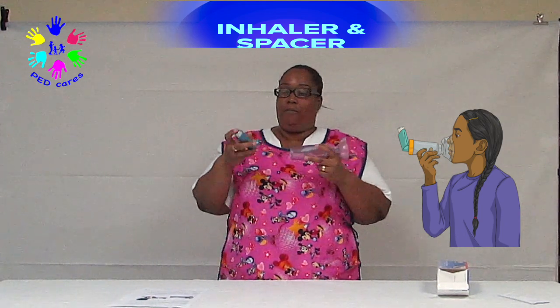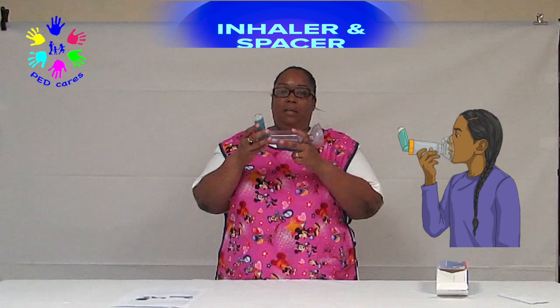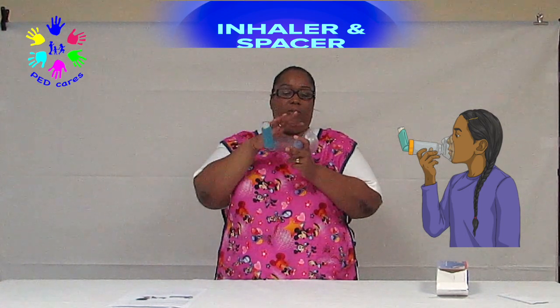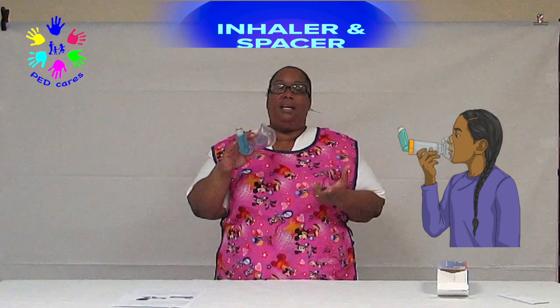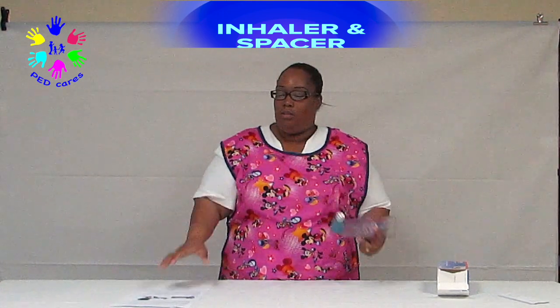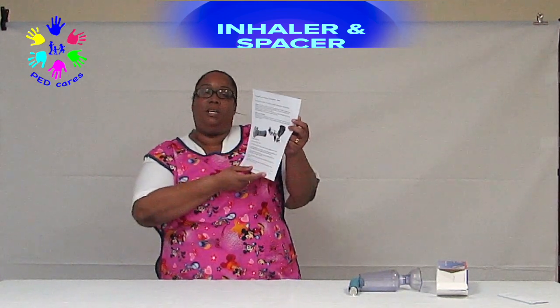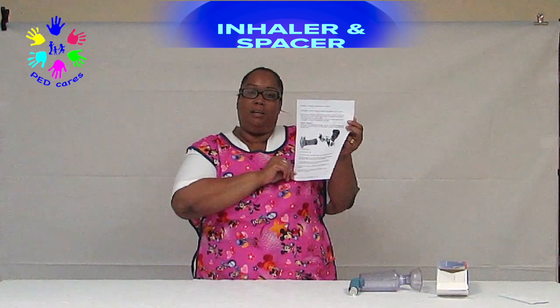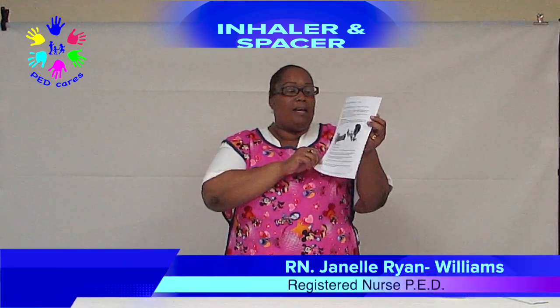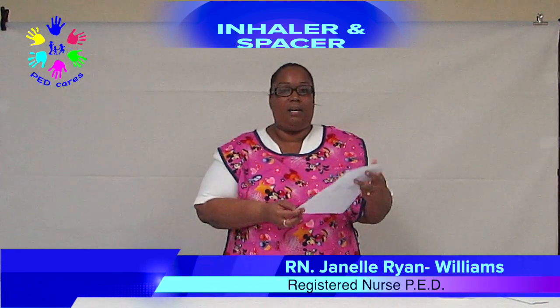So again, to reinforce, you need to shake the medication, insert it into the bottom end of the chamber, administer the puff with the face mask, forming a tight seal around the nose and the mouth, and breathe in and out for about 10 seconds. Your doctor would have given you a discharge sheet to take home with you, telling you exactly when and how many puffs to be taken. So remember, this advice sheet is very important and it will help you to resolve your asthmatic attack at home.